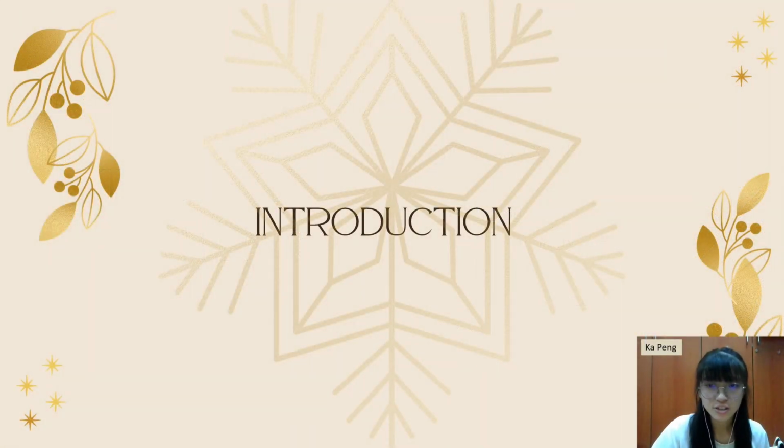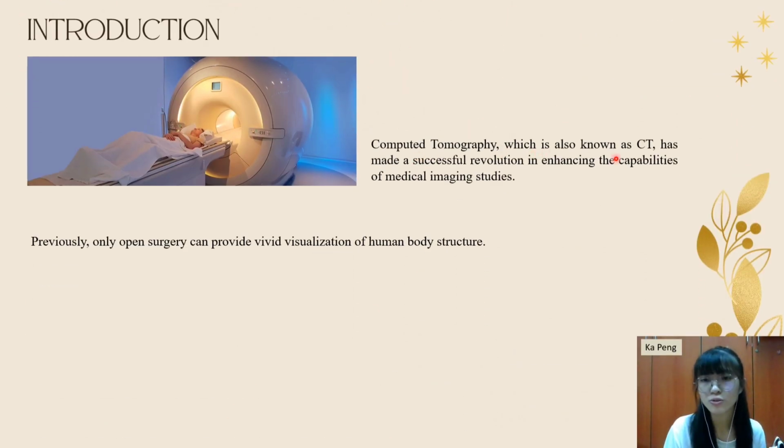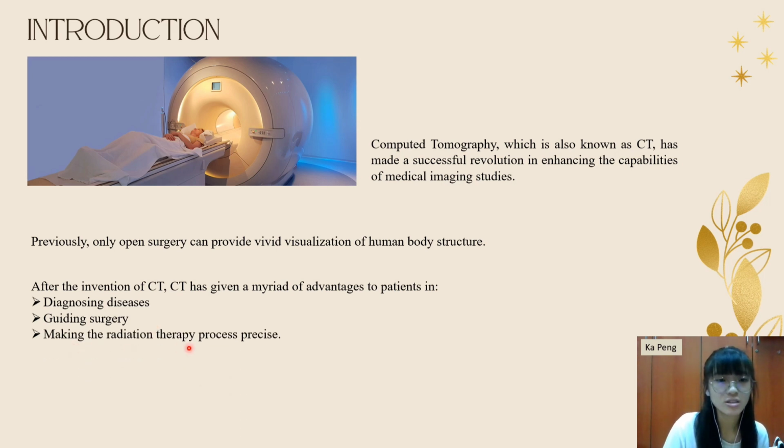Let's start with the introduction of CT scanner. Computed tomography, also known as CT, has made a successful revolution in enhancing the capabilities of medical imaging studies. Previously, only open surgery could provide vivid visualization of human body structure. However, the invention of CT has given a myriad of advantages to patients in diagnosing diseases. The second one is to guide the surgery, and the third one is to make the radiation therapy process precise.